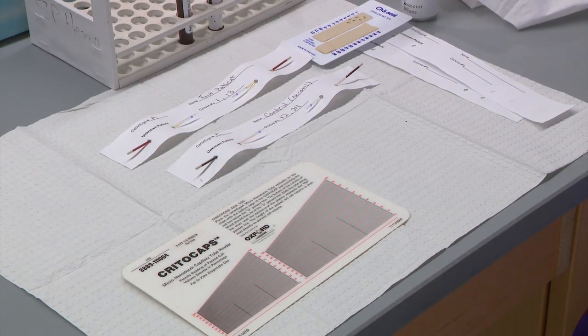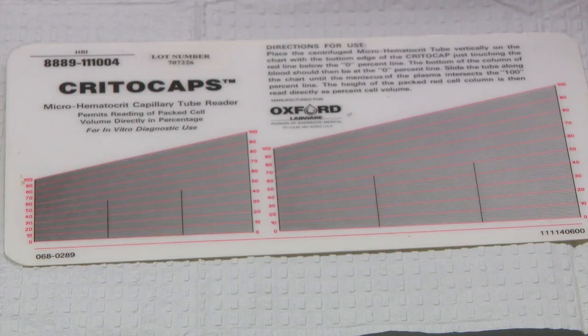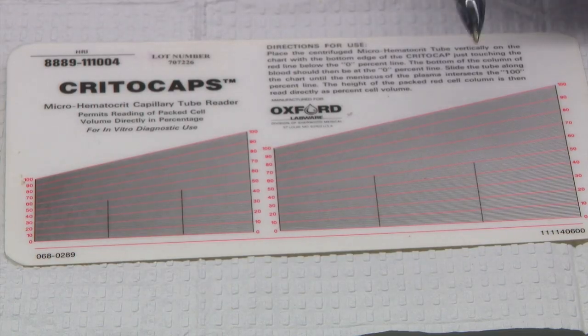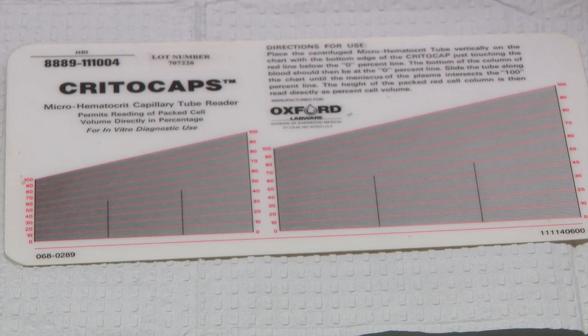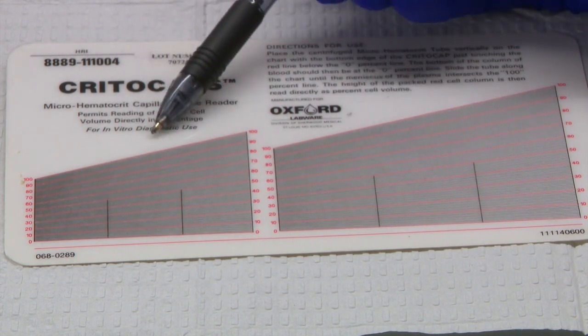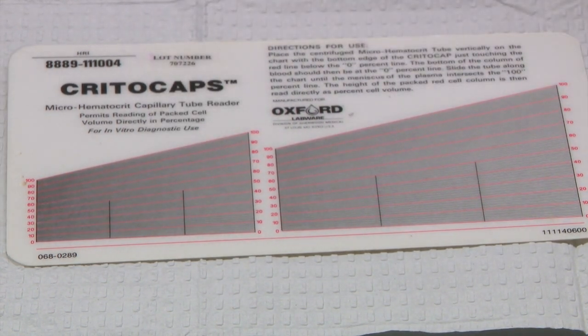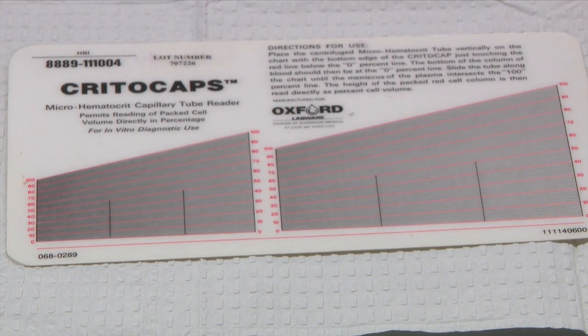We are going to start by reading the values of the control micro hematocrit tubes. To do this, we use a hematocrit manual card reader. On the card, there are two charts to place the tube to determine the hematocrit value. In general, we will use the chart on the right.